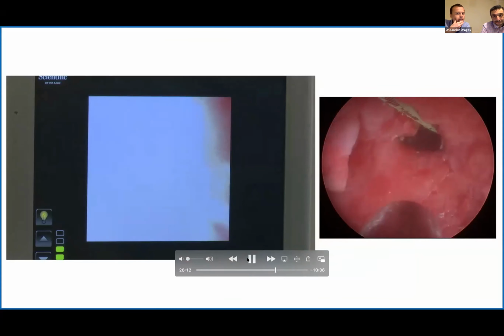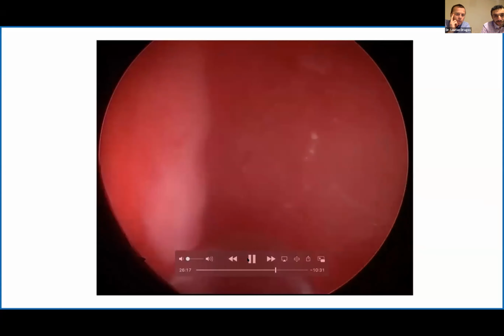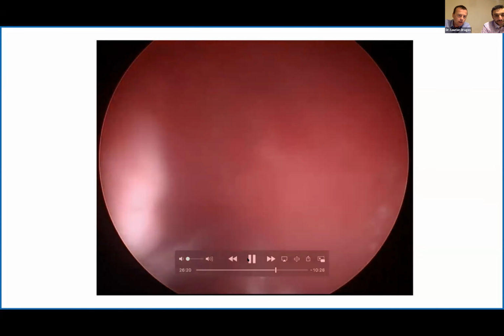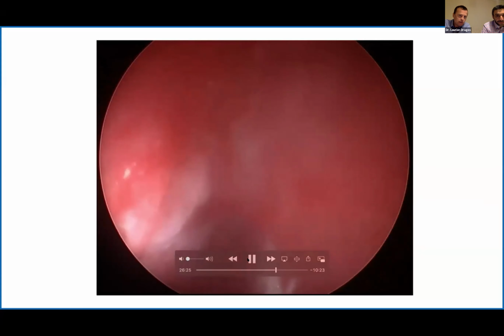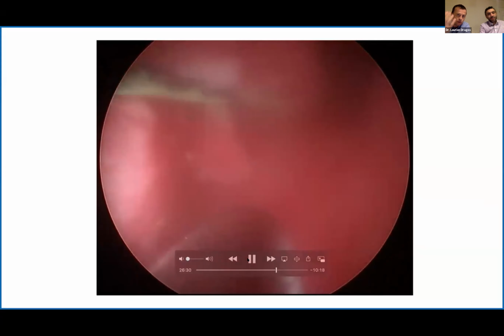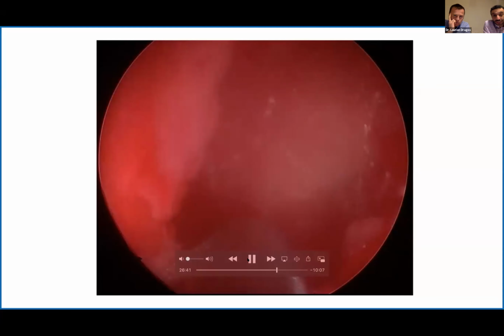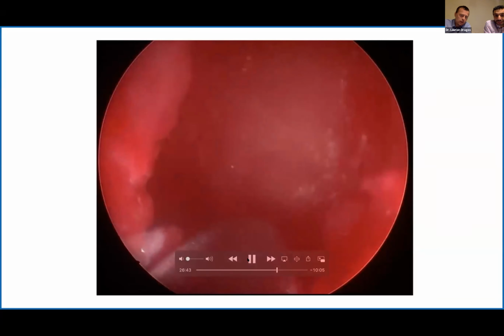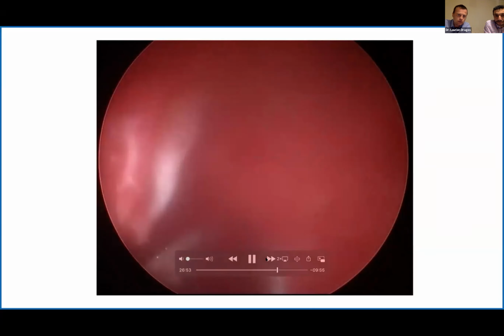I said, look, this is going to take us too long, and maybe you should give it one more go and try to reach with the probe into that calyx. Obviously, he's trying, but you can easily see that the tissue starts tearing, and he didn't push, so he didn't force. We were anticipating that, but we thought, look, we need to change that strategy. Let's have a go, see what happens, which was unsuccessful, as expected. He stopped, and we went back to what we did before.